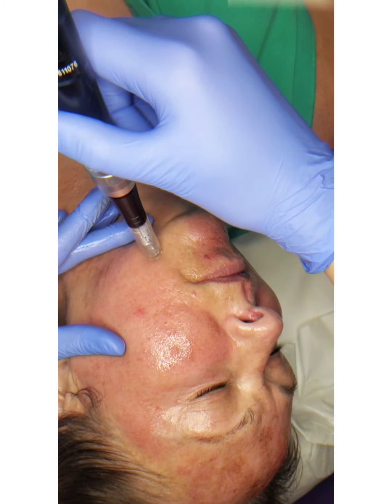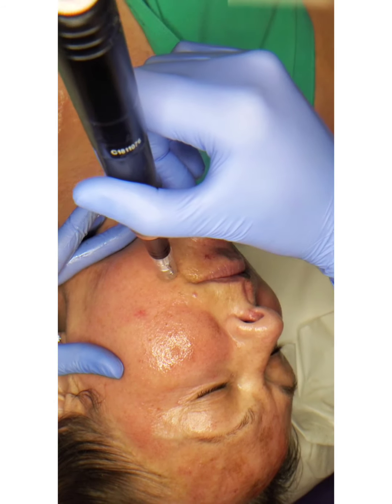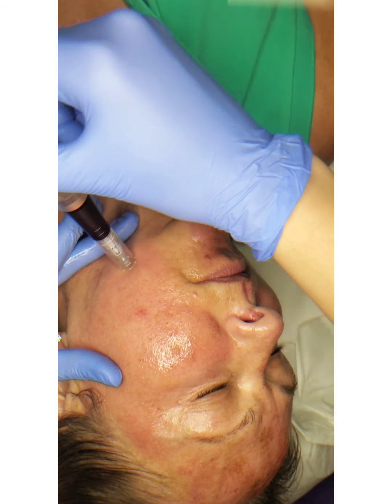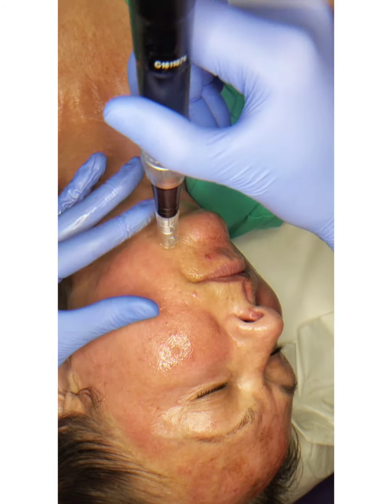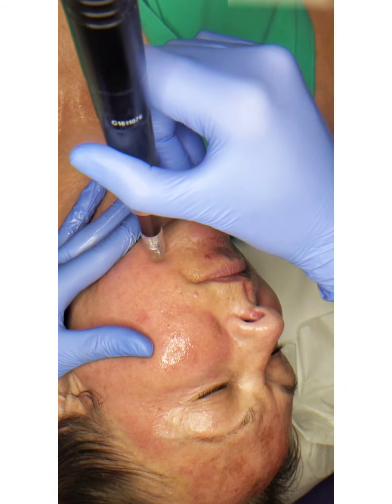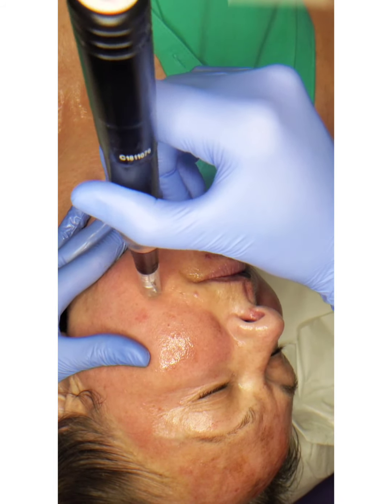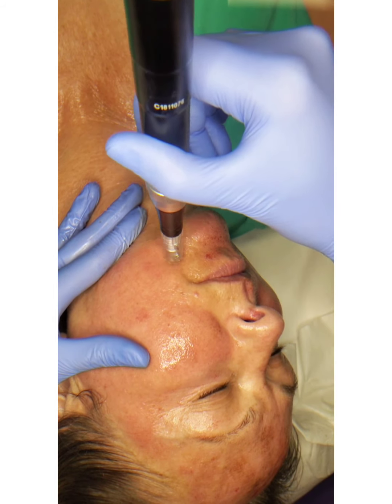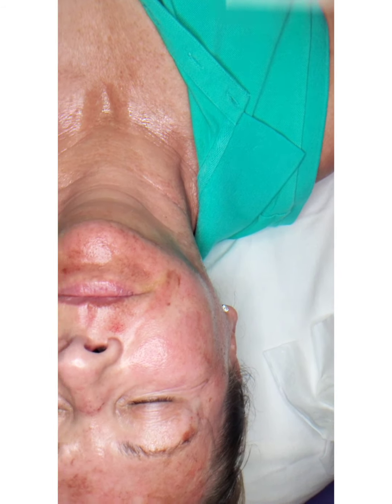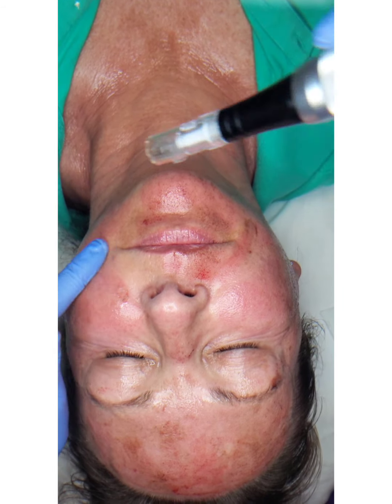Now I'm sure it's still helping in some way, but if it reaches the dermis and if blood is coming, the pinpoint bleeding, it has to be in the dermis, because the blood is coming up, and that's where the blood is found, in the skin. So why that's important is that's what's boosting the collagen. That's what's strengthening the elastin. Elastin is what keeps your skin from getting saggy, from wrinkling, and this just smooths everything out. That's why it's so important.